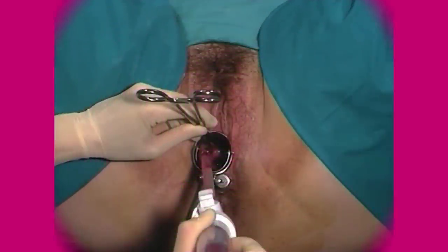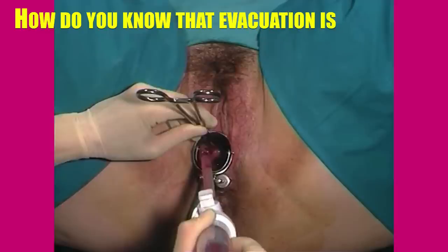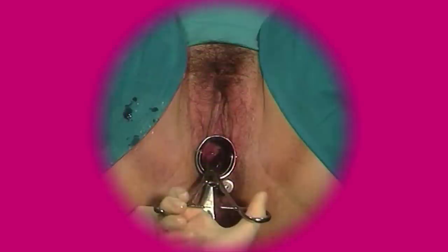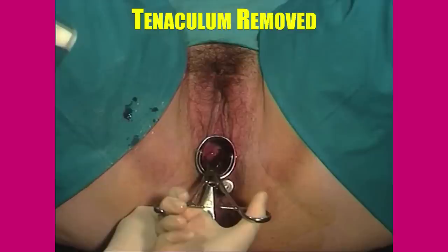A question commonly asked about MVA is: how do you know that the evacuation is complete? It is complete when: 1. No products can be aspirated. 2. The uterus appears to contract around the plastic cannula. And 3. There is a grating sensation — that is, a gritty texture to the uterus. After the procedure is complete, the MVA syringe and cannula are removed. Make sure that there is no further bleeding from the external os.